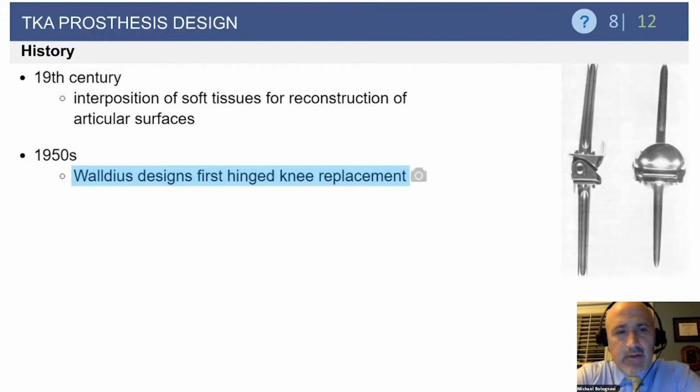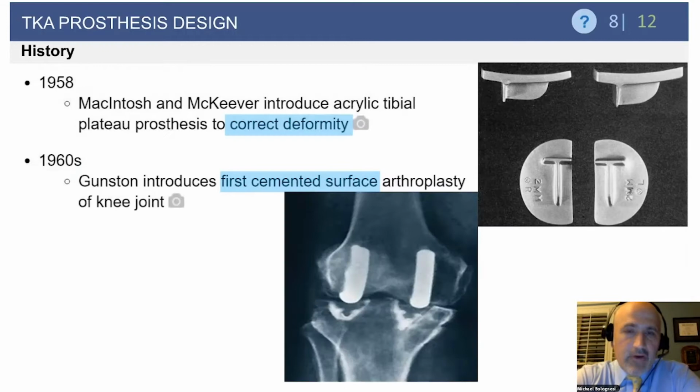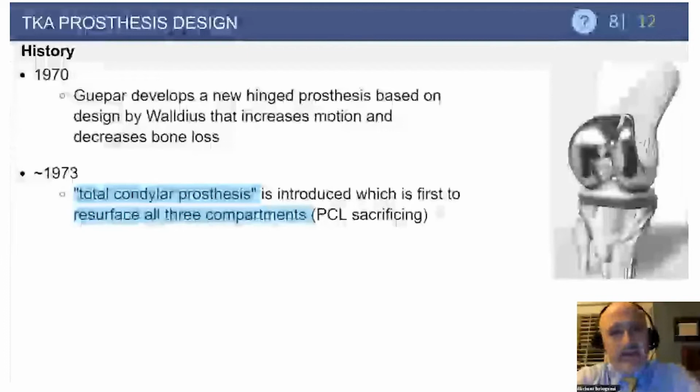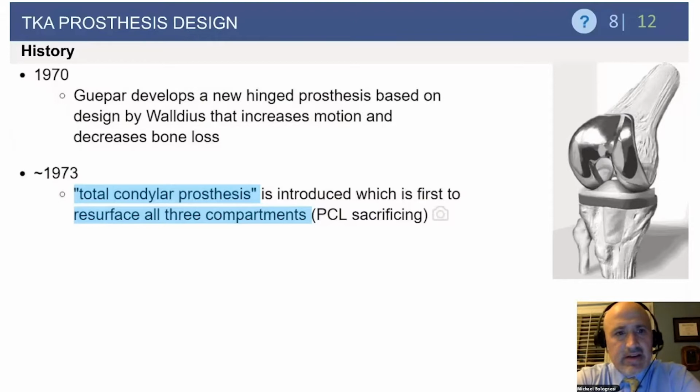A little bit about history. The idea here, of course, was an effort that at first was an interpositional type arthroplasty using soft tissue to reconstruct the articular surfaces. The first metal prosthesis designed, which was a hinge, was a Waldius in the 1950s. Things progressed from there. In '58, McIntosh and McKeever introduced acrylic tibial plateau prosthesis to correct deformity. And Gunston first introduced a bicondylar surface cemented arthroplasty of the knee joint in the 60s.